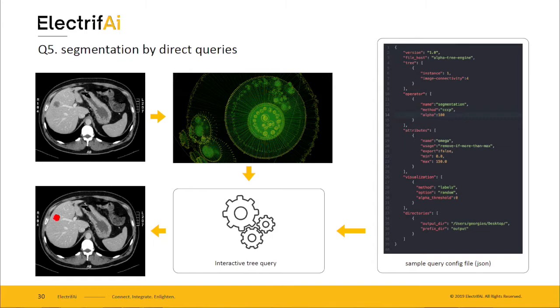In the absence of this algorithm, and given the fact that you might start with no training data, then you can do that with a simple query. So you just specify yourself what it is that you suspect might describe this best, and indeed, you can get the same result out.